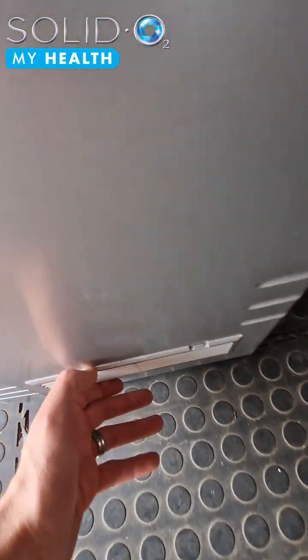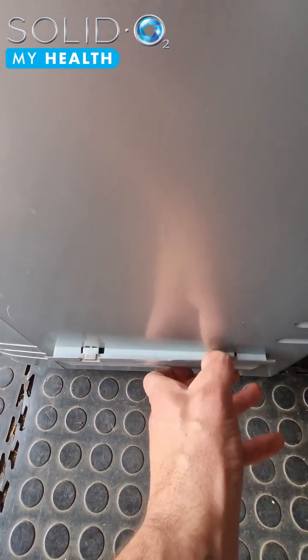Now you can get away with cleaning and washing your general first line filters. This is your general dust filters. It's there specifically to catch your general dust and cat hair.